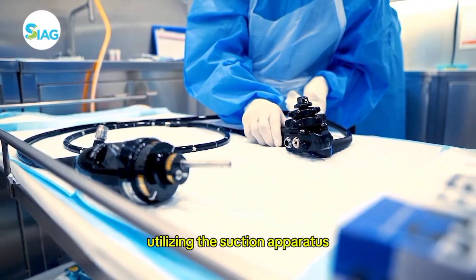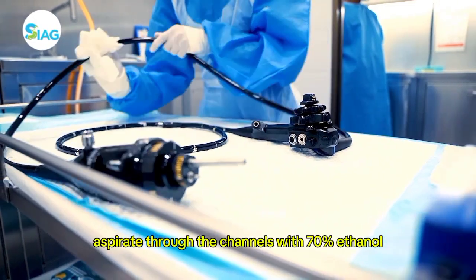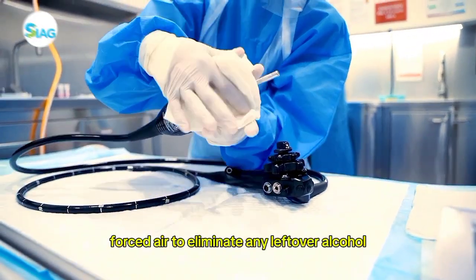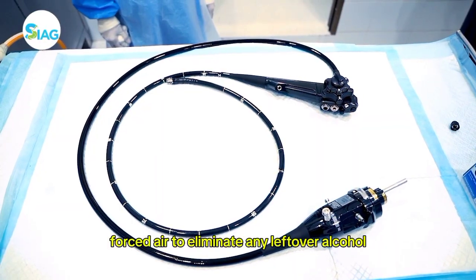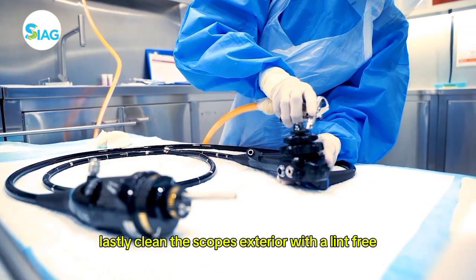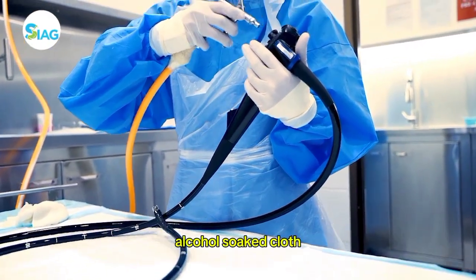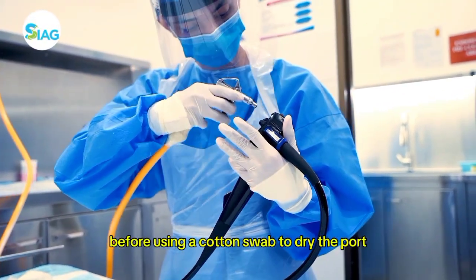Utilizing the suction apparatus, aspirate through the channels with 70% ethanol. Next, utilize compressed forced air to eliminate any leftover alcohol. Lastly, clean the scope's exterior with a lint-free, alcohol-soaked cloth before using a cotton swab to dry the port.